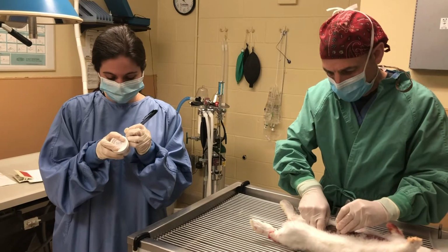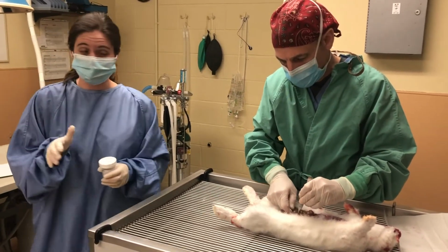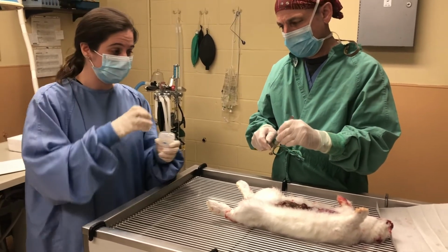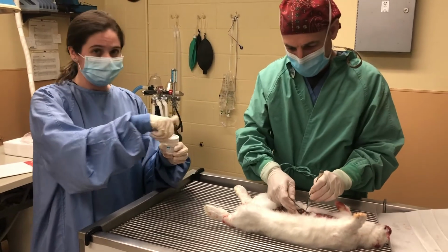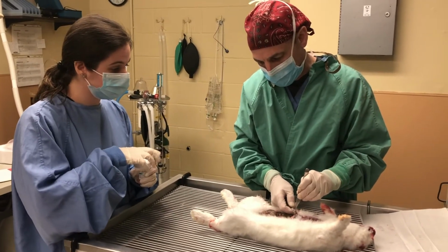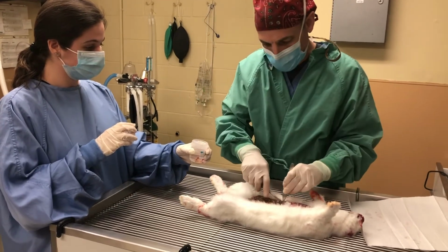Next, going to get a kidney sample. And for the purpose of this demonstration, normally you would have different jars for different samples. In this case, we're just going to be using the same jar. But again, normally you would have them in their own separate containers. Going to get a sample of stomach.